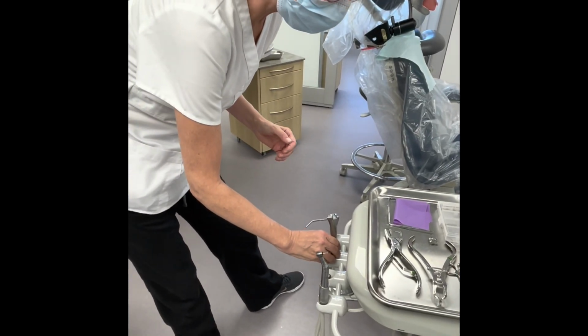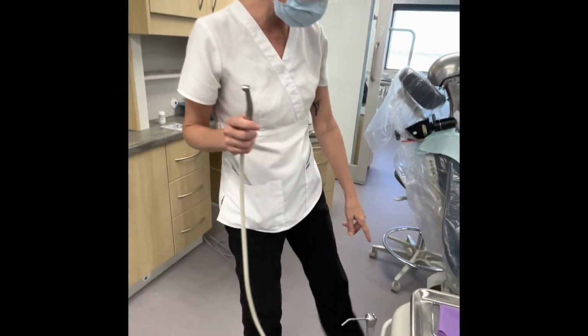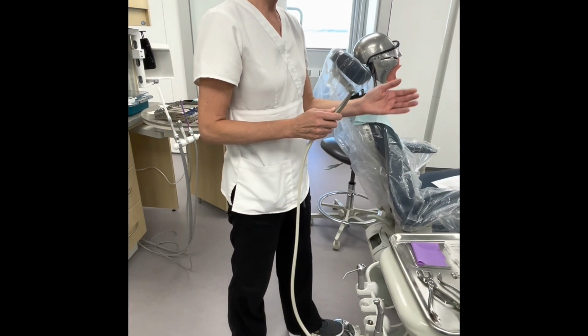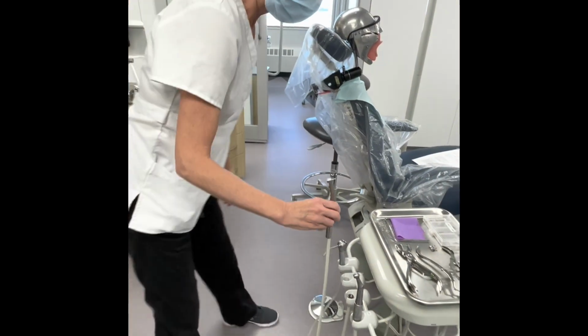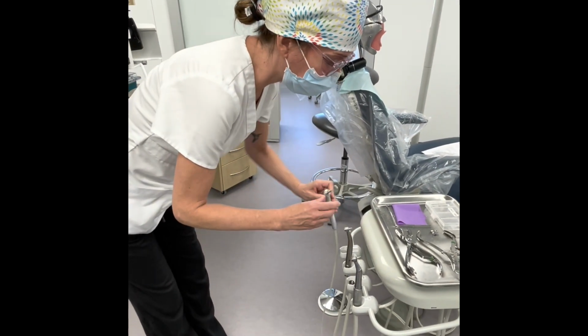Next is my high-speed handpiece, and high-speed handpieces are run with water, so that's why I needed to make sure that toggle was turned on properly. I'm just gonna run this and make sure that the water is coming out. I can see that it is. So again with this, I'm gonna make sure it's pointing towards the tray troll.